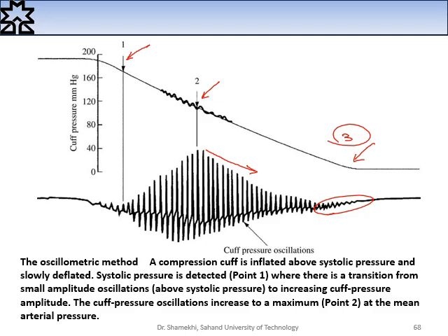Therefore, if they ask us which pressure can be detected exactly by this method, we should answer only the mean pressure can be detected reliably by this method.